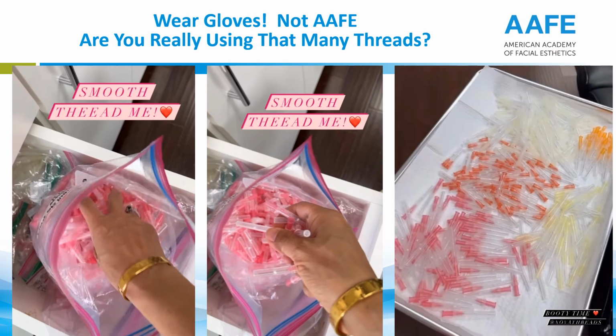And again, let's look at that tray. This is not the AFE, this is not vSoft Lift, but please use gloves. And another major mistake that they've done here is your PDO thread should stay in its original packaging, which are airtight sealed packages. Take out what you need, then put it back in there. Never ever dump your PDO threads into a big plastic bag. Why? Because air leaks through those plastic bags a lot worse, and air will degrade the PDO threads when you store them like this. Maybe that's why this person needs so many threads.